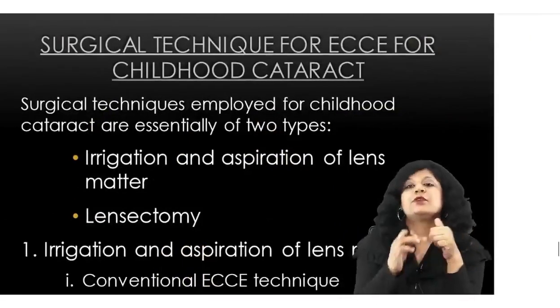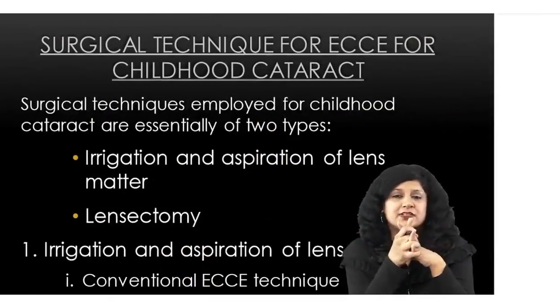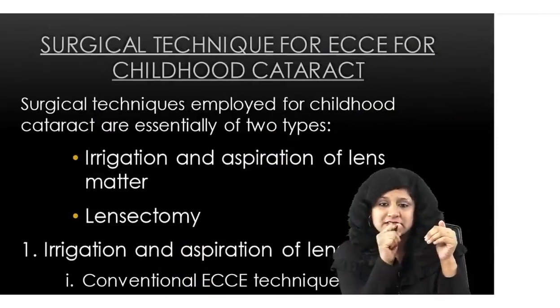Now let's see some of the techniques which are used for childhood cataract surgery, because you know childhood cataract surgeries are somewhat different from the adults.